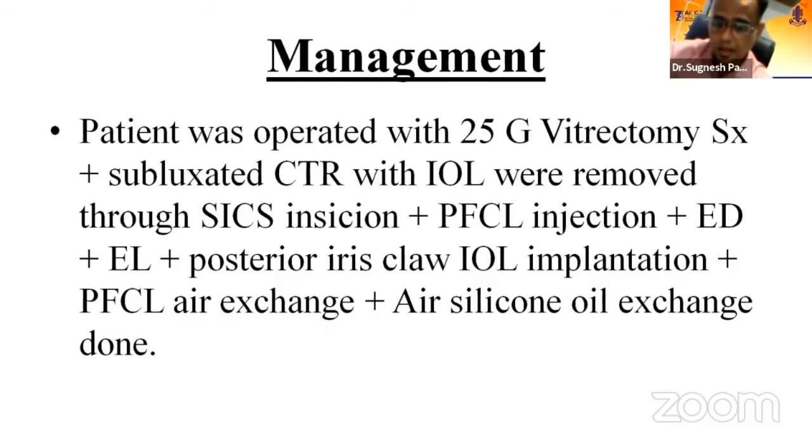As I had the IOL power available with me because the patient was operated only 3 months back, and there was no support for the IOL, I opted for a posterior iris fixated lens. Then PFCL was exchanged with air, and air was exchanged with silicone oil.